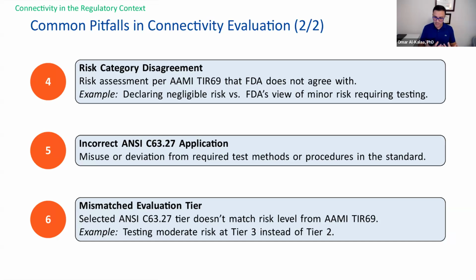So please take that exercise with as much attention as you can dedicate to it. It is an important exercise. If you end up in the wrong risk category, that will prolong the period during which you're evaluating and going about your testing for the device, and then it will result in a back and forth with the FDA. So don't pick negligible because it says you don't need to test after it, unless it's really a valid position.